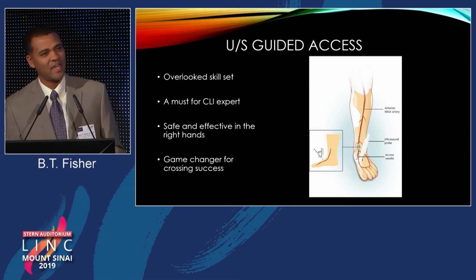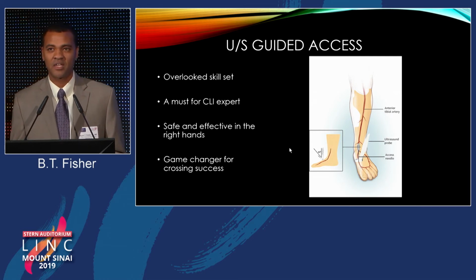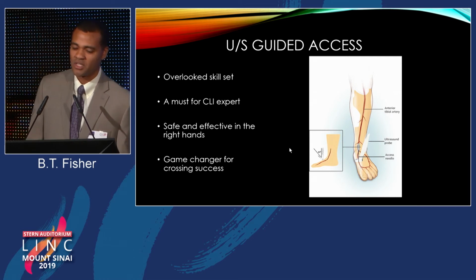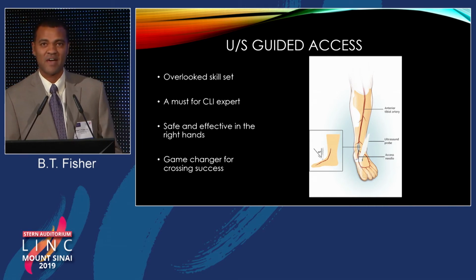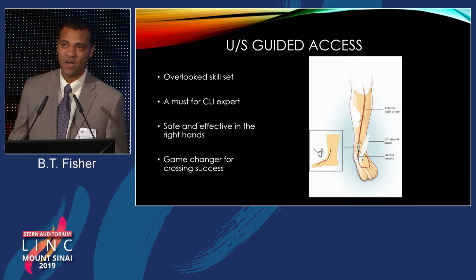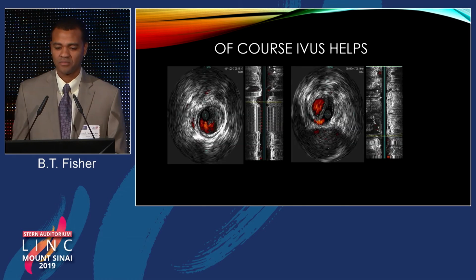But again, in the right hands, it's an absolute game changer and can change the technical success of crossing a lesion from probably 60 to 70% all the way up to 90, 95+%. Again, that's without using a reentry device.